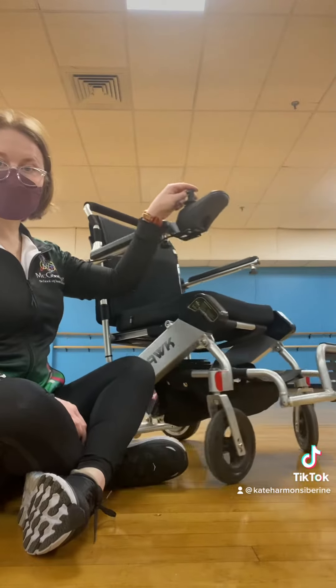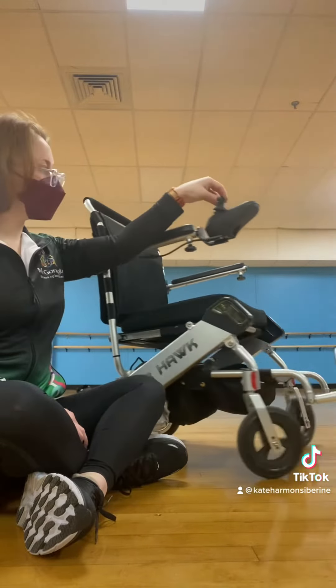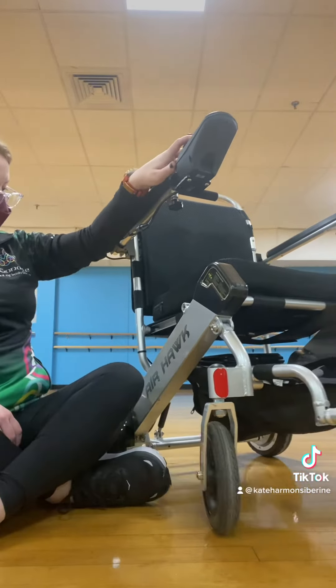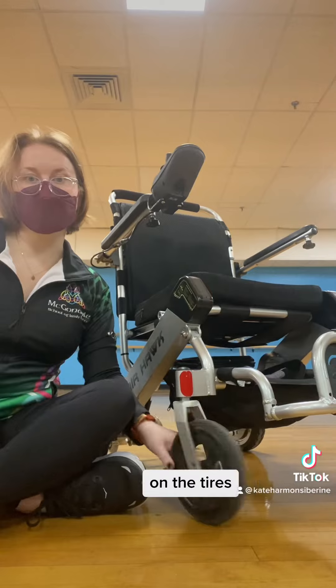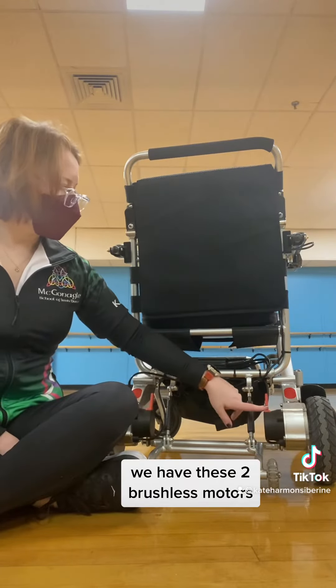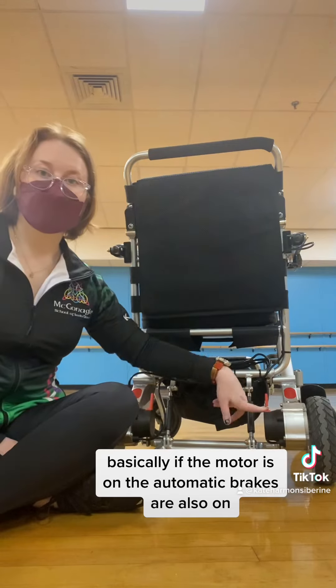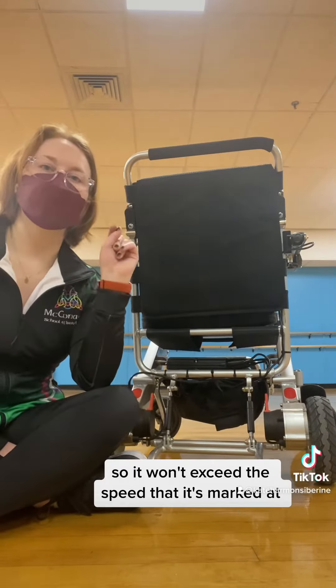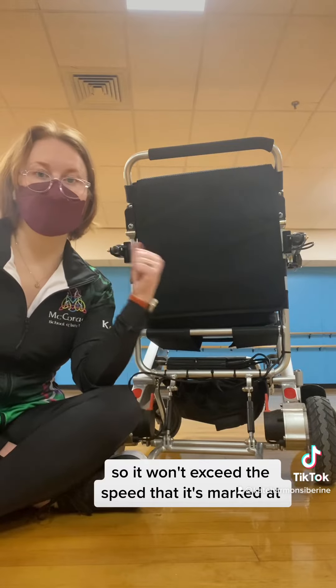Here's the joystick. It comes in five speeds. The traction's pretty good on the tire. We have these two brushless motors. Basically, if the motor is on, the automatic brakes are also on, so it won't exceed the speed that it's marked at, which is really helpful for going down hills.